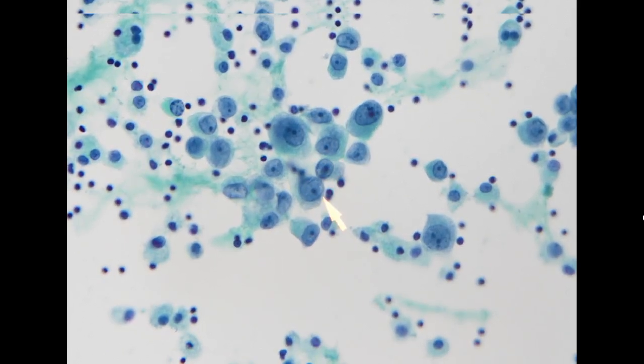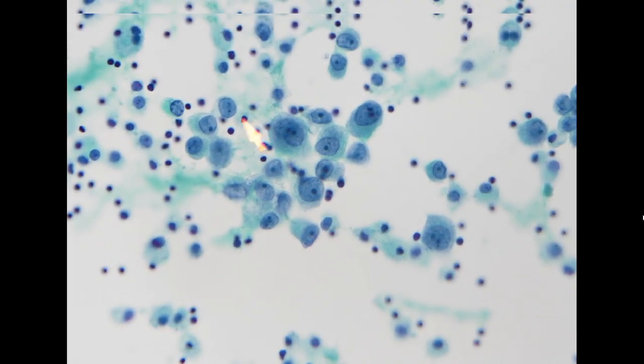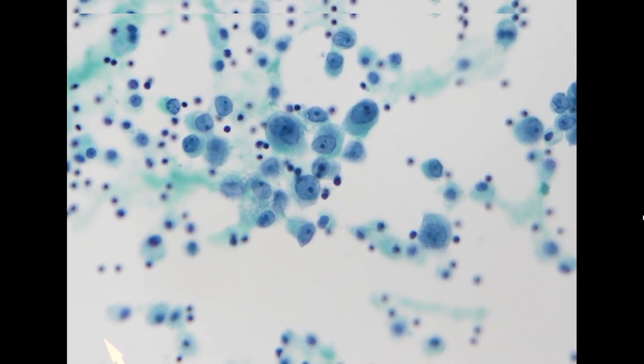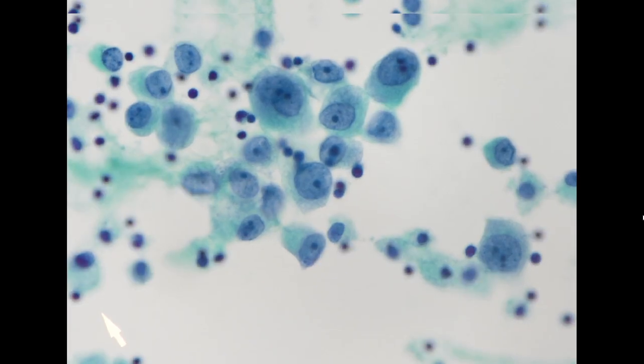And here we can appreciate what we call vesicular chromatin very clearly. You can see there are smaller vesicles within the nucleus. This is a typical morphologic feature of a poorly differentiated adenocarcinoma.